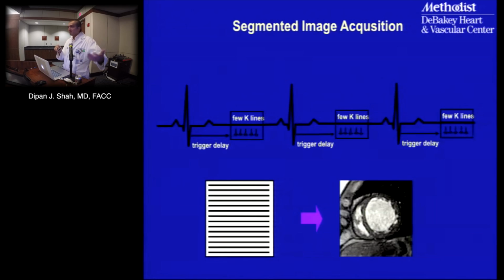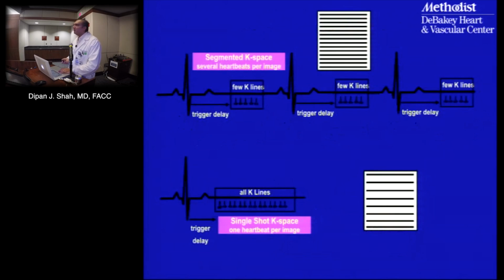If the patient has an arrhythmia, like a PVC or something else, that causes the rhythm to not be exactly the same, and that could also cause a problem with the image I generate, because things are actually different. The different lines of data that I obtained are not exactly the same. They're not exactly symmetric.